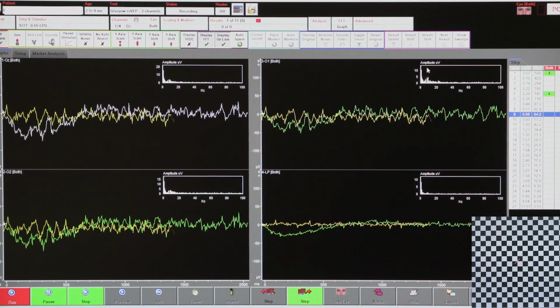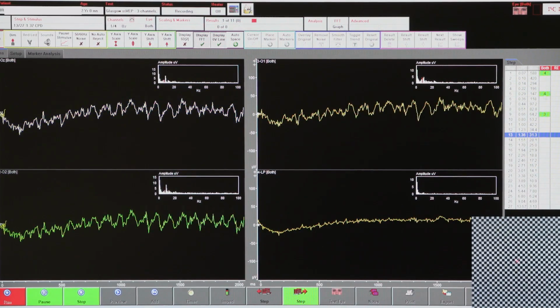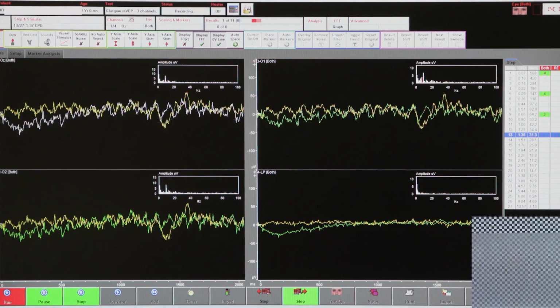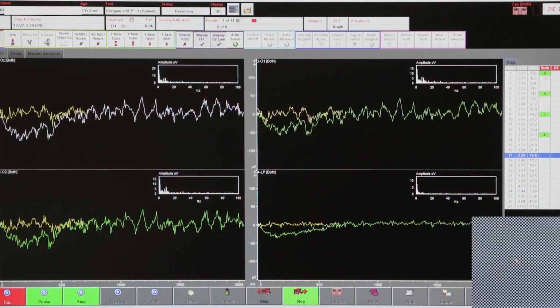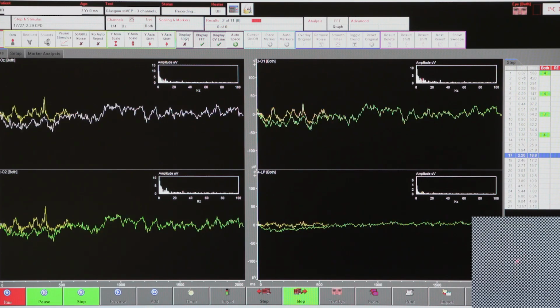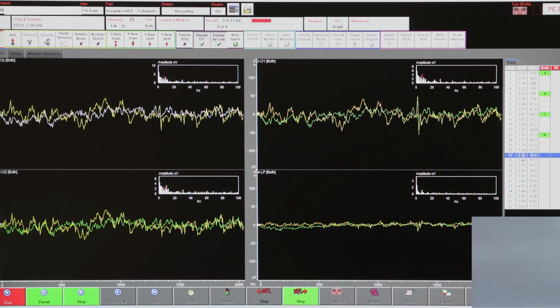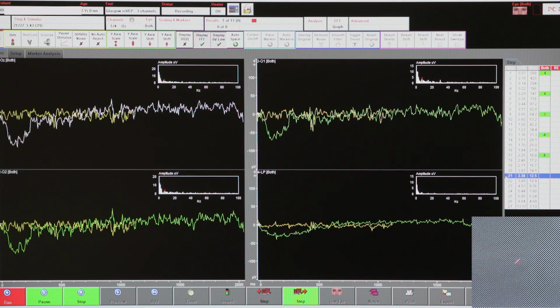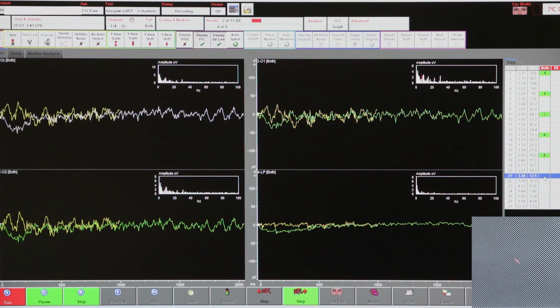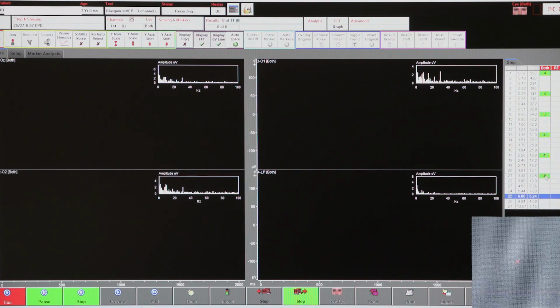If the VEP is quite big and fixation is good, the VEP can be detected in 1 or 2 seconds, so it can be pretty quick. The detection statistics have been designed to keep the overall false positive rate at about 5%. We flag check sizes in orange where the VEP was close to being statistically significant, but they are nonetheless treated as a no, as a red check size by the algorithm.